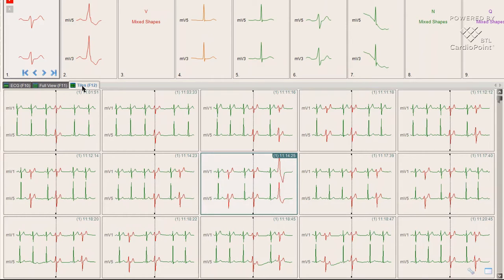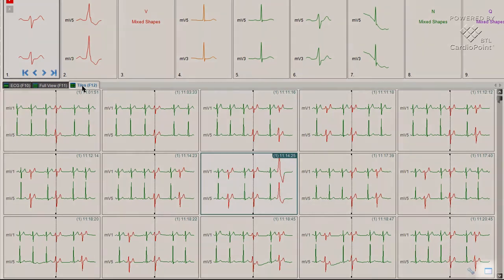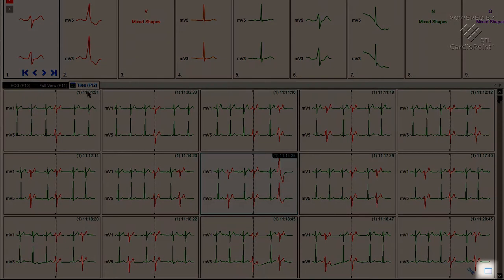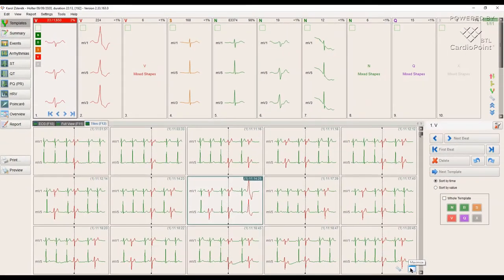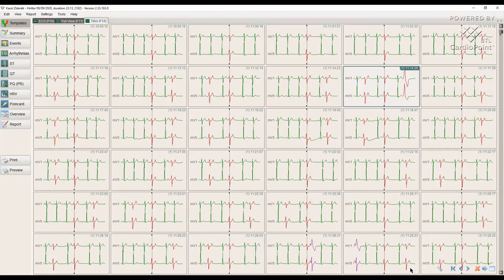It significantly speeds up the work with the signal. It is also possible to show the signal in full screen, which allows us to see even more complexes at once to speed up the process of Holter analysis.